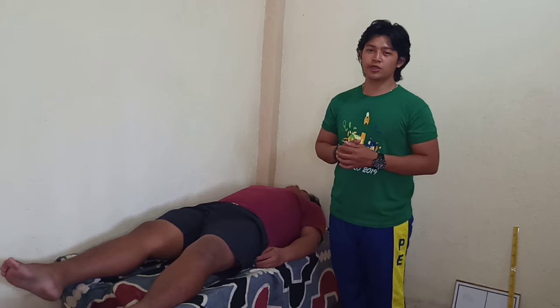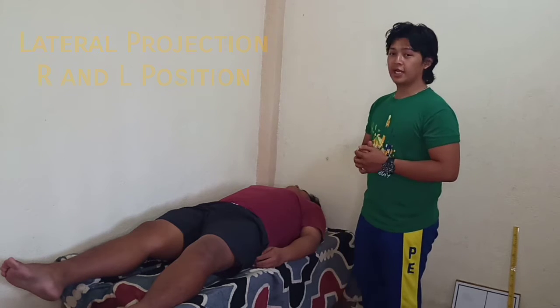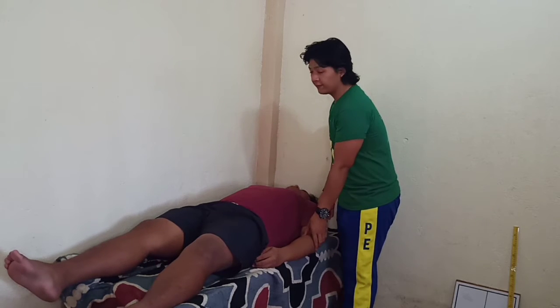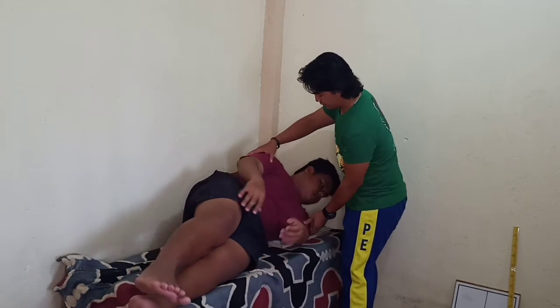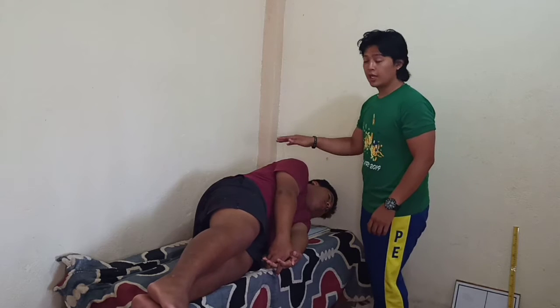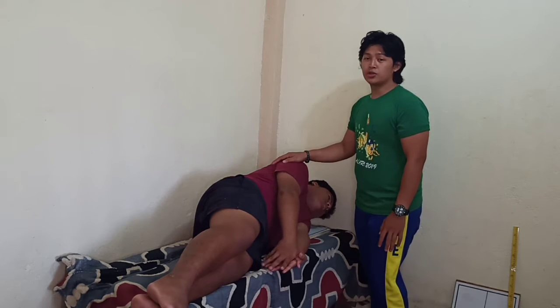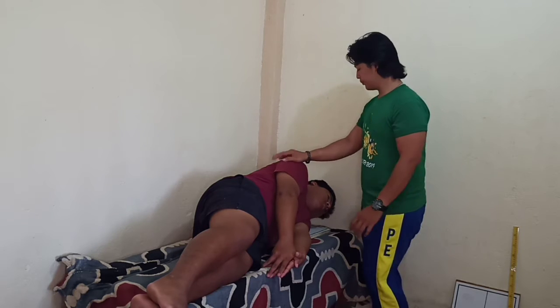The second projection of the thoracic vertebra is the lateral projection, right and left position. First, place the patient in left lateral recumbent. As much as possible, left, to place the heart closest to the cassette and to minimize overlapping of the heart and the vertebrae.